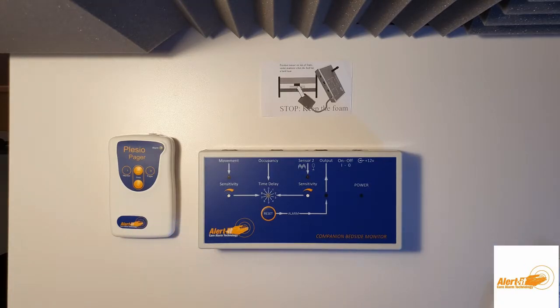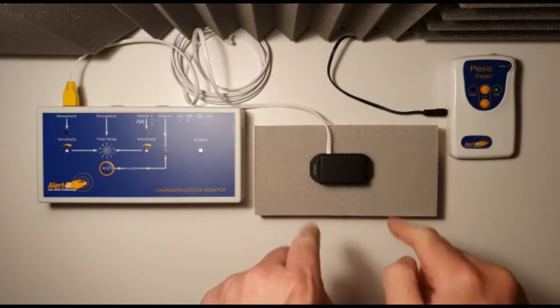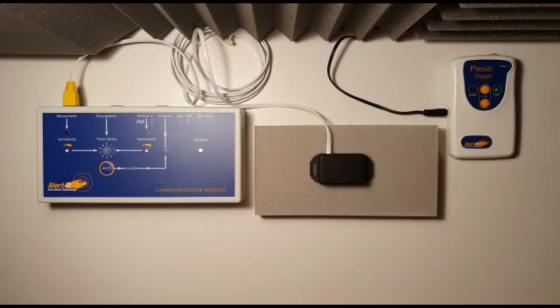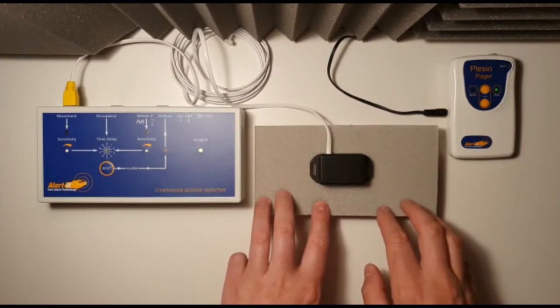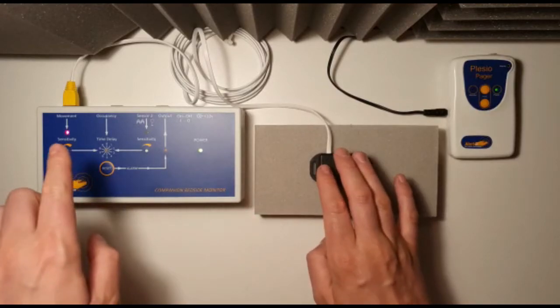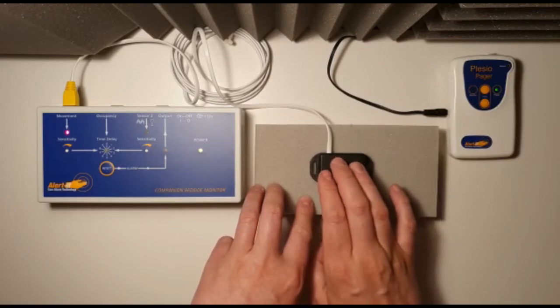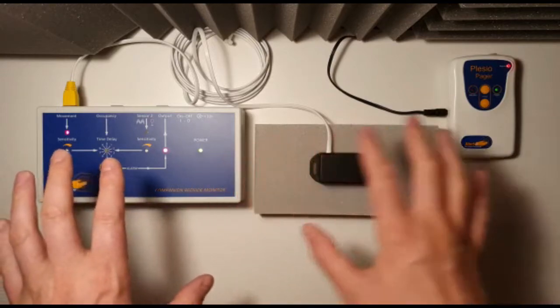In this part of the video, I'll be demonstrating how a seizure would happen using the movement sensor we have here, which is connected to the companion bedside monitor on the left there. The Plesio pager we have on the right has already been paired to the companion. So all we need to do is simulate a seizure using this movement sensor, which should usually be under the mattress. So if we tap like this, we should receive a light there on the monitor. Now that just means the monitor can sense movement. Now this is set to 15 seconds of continuous movement. Now it's gone into alarm mode.